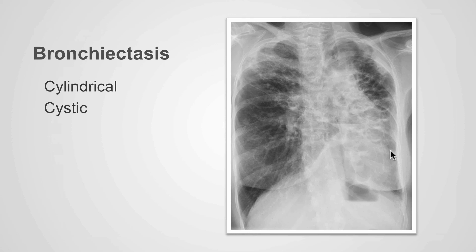In this case, we see multiple cystic areas within both lungs that contain small air-fluid levels. These are infected bronchiectatic cysts, predominantly within the left lung, but also present on the right.